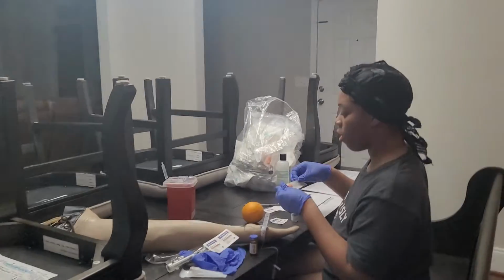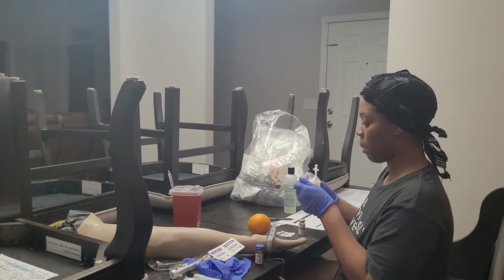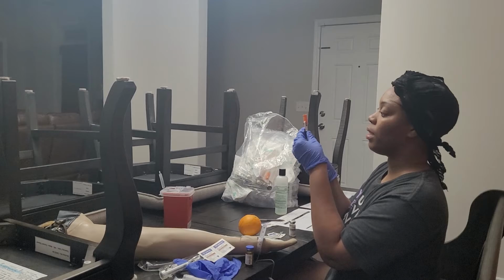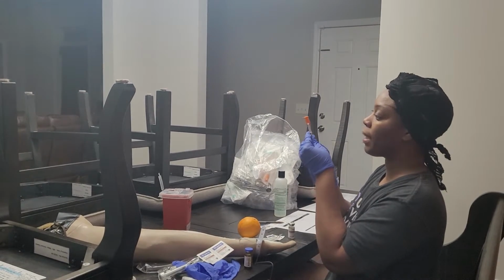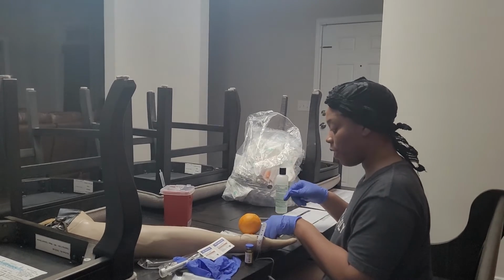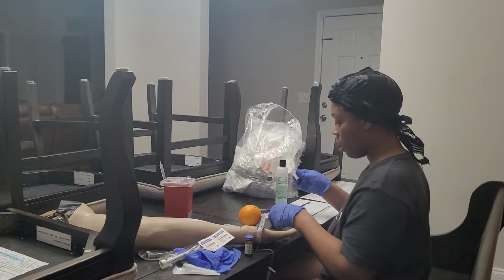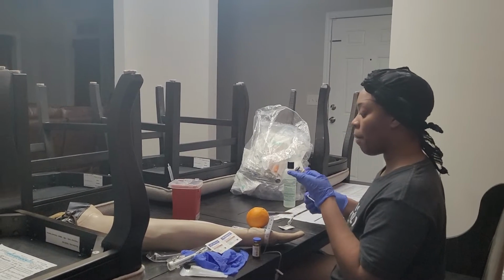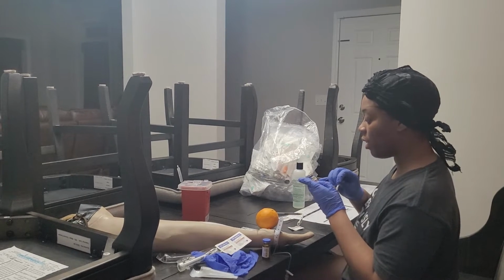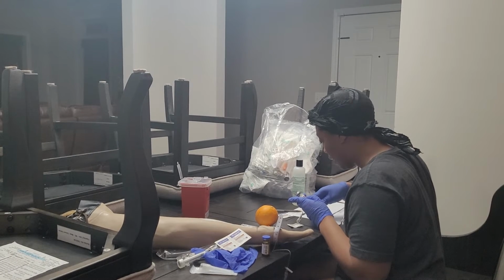And I'm going to draw up 10 units. This is my insulin needle. I'm going to pull back to the 10 because I'm going to need to inject air in here so that I can draw back with minimum air bubbles. I'm going to clean off my top, and right now I'm going to double check my medication, which is insulin Lispro. I'm going to check that against my MAR again, insulin Lispro.